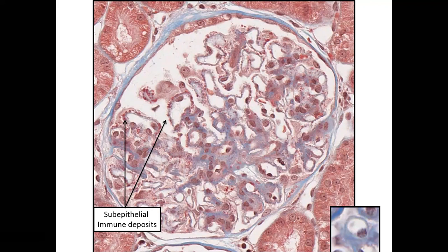And so it might be important because we don't want to overinterpret scarring and say, oh my gosh, there's a whole bunch of tubulointerstitial scarring, when in fact it's just a little bit of collagen and a lot of edema. The edema can go away and the collagen would stay. So sometimes that pale blue matrix, which we don't have an example of in this picture, would be more, I guess maybe down here. It's a pale blue color, but it's not necessarily dark, dense blue collagen. So I will often exercise caution and make sure that I'm not over-calling scarring, because scarring would be irreversible and edema would be reversible. Okay.